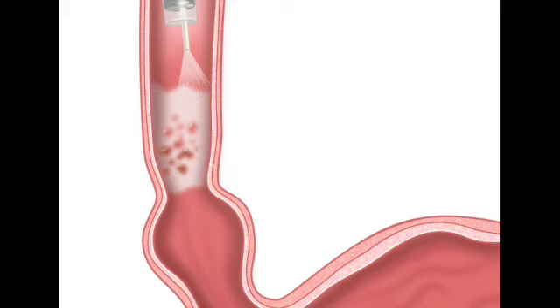And the bad cells, neoplastic cells, on the other hand, are chaotic. I mean, cancer and precancer are basically defined by disorganized, rapid, messy cellular growth. Right. Because their internal structure is chaotic, they physically cannot maintain that protein reaction. The acid washes over them. They might briefly turn white, but they rapidly lose it. Wow. So they paint the tunnel, everything turns white, and then suddenly, as they watch the screen, certain patches start reverting to pink while the rest of the tunnel stays white.